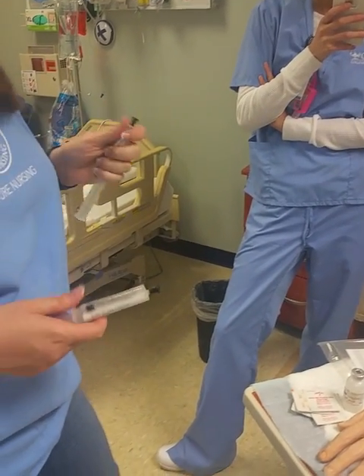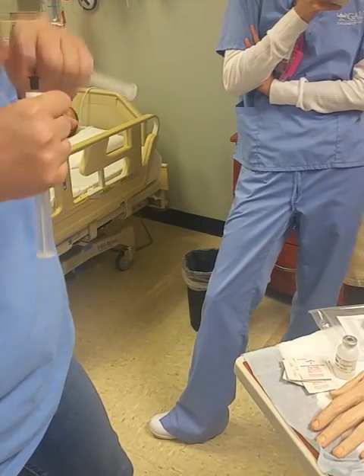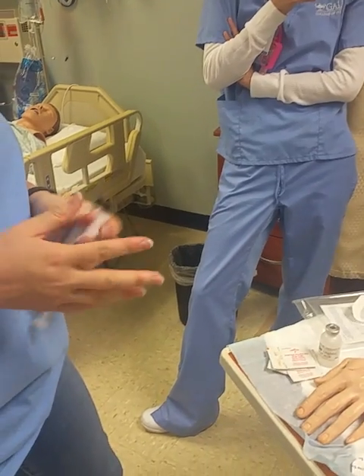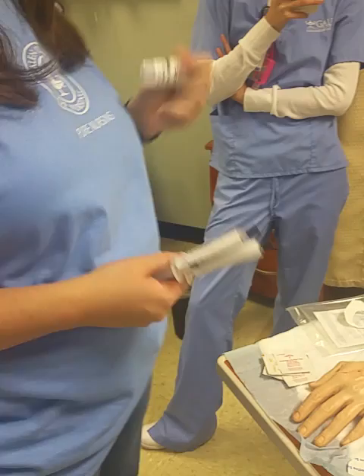I recommend drawing it up in the patient's room just to save you that whole, what do I do with the end of this syringe that's exposed? What do I do about labeling? I'm just going to go in the patient's room and do it. I need this to scan in the computer anyway.